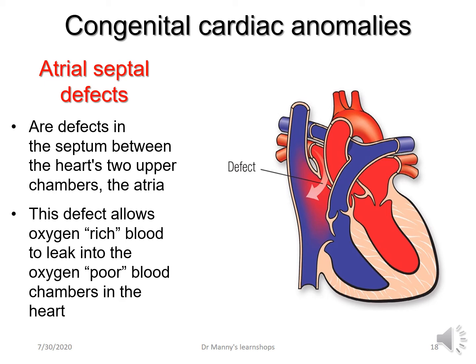There are numerous atrial septal defects which we're not going to go into, because with these anomalies, an echocardiogram is probably the most diagnostic tool to use to identify them. All patients with cardiac anomalies will require an echocardiogram and possibly further investigation. The chest X-ray is the simplest, easiest tool to implement to possibly diagnose that there is a cardiac problem.